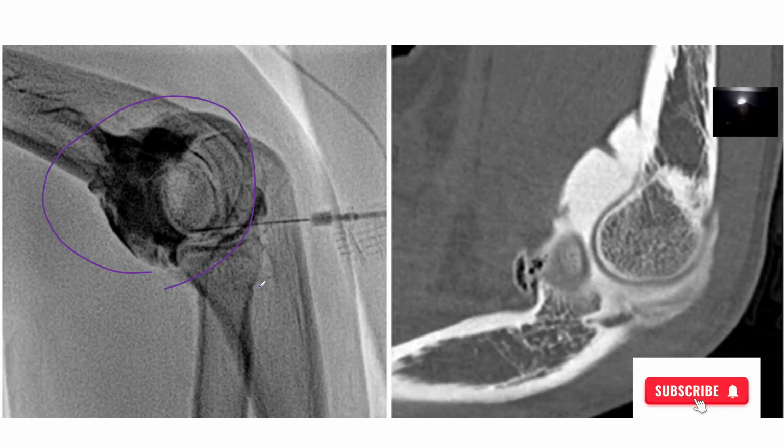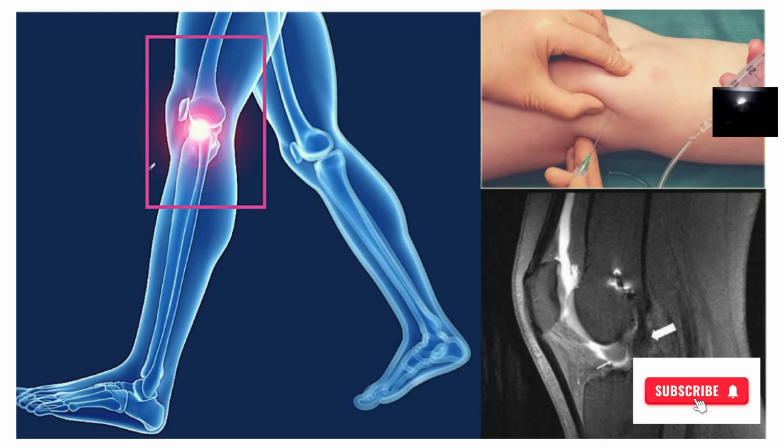Do you understand? And as I'm actually injecting this joint, of course there are many structures in the joint, so I don't want to injure any one of them. So I'll now use what? Ultrasound to guide my way in. So this is how they do it. Inject it and get the image.